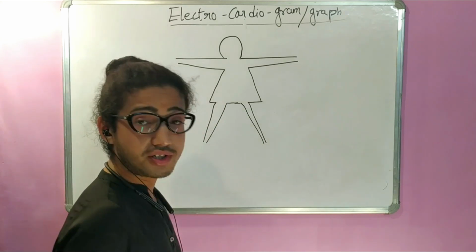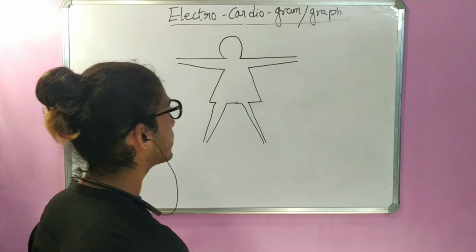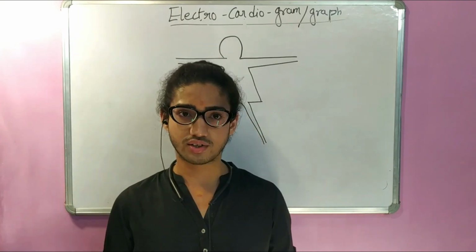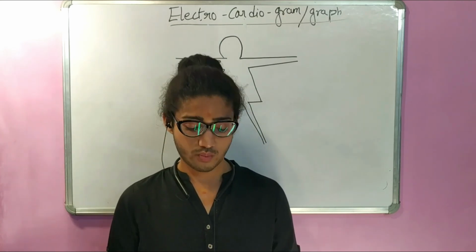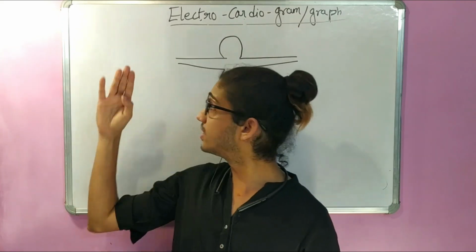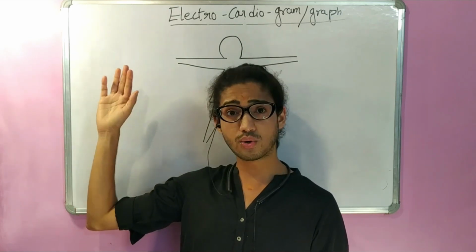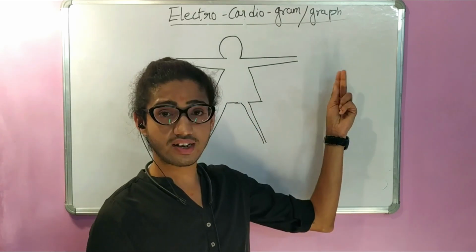So as I mentioned, the leads or the electrodes that we're going to discuss first. So there's one electrode, and also always remember this, guys, that whenever I'm drawing any structure related to your organ or related to your body, when I draw it, this is my right. Okay, as you can see in the video, this is my right. So this side of the board will be right. It's usually opposite when it comes to mathematics, but it's like this when it comes to biology. So right will be the right side and left will be the left side.